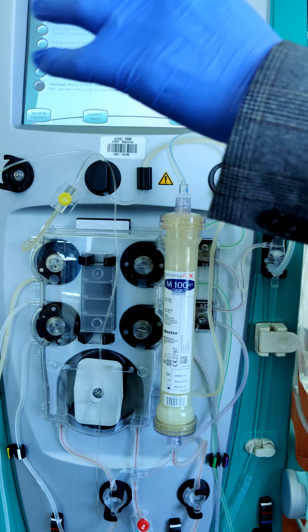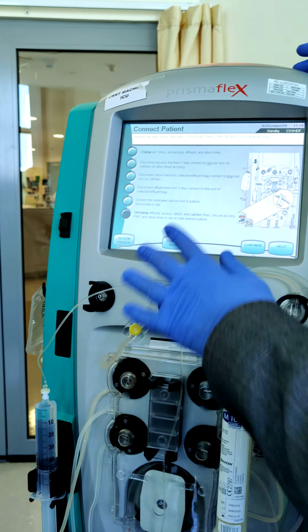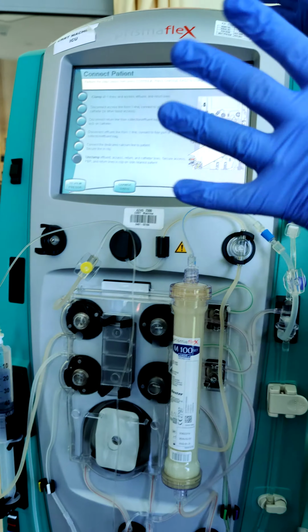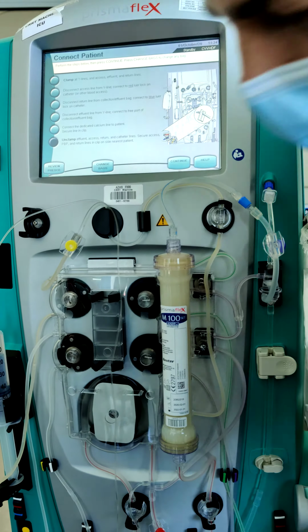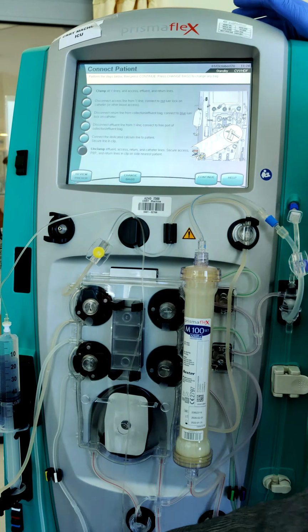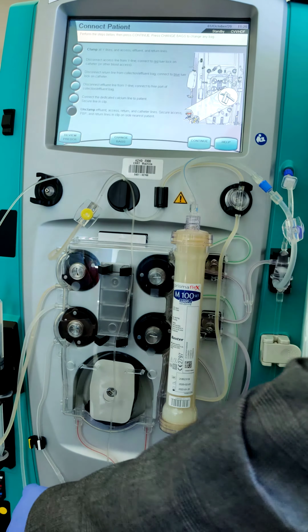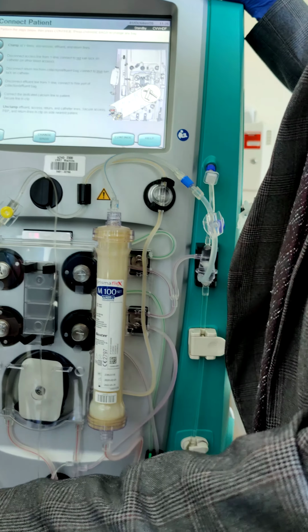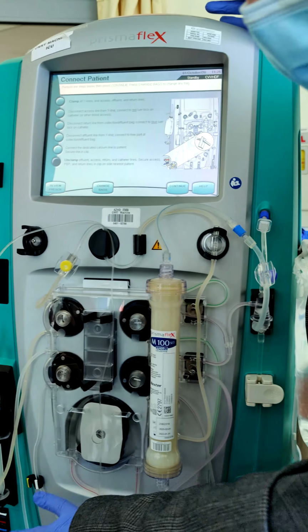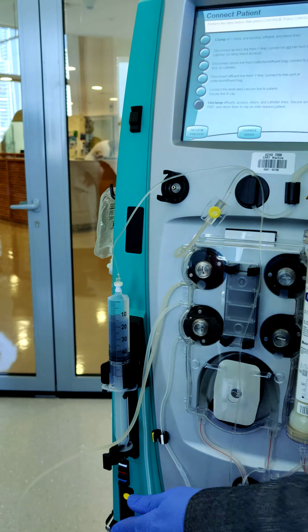Before we continue, if you want to change the effluent bag, this is the effluent bag. If you did mini priming or you repeated the priming and it's a little bit full, just change the bag: remove the scale, remove the effluent bag, empty it, and replace it. Attach, and remember to unclamp the lines after you replace any bags. Okay, everything is okay.